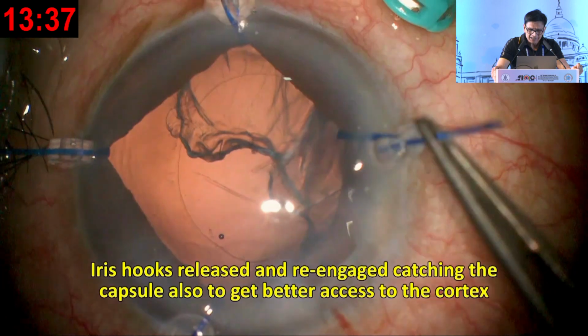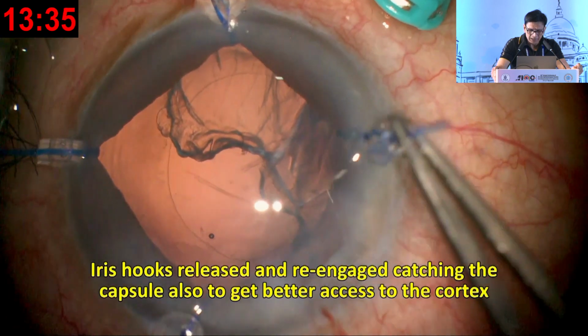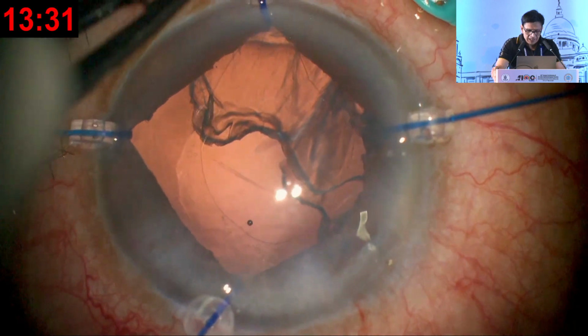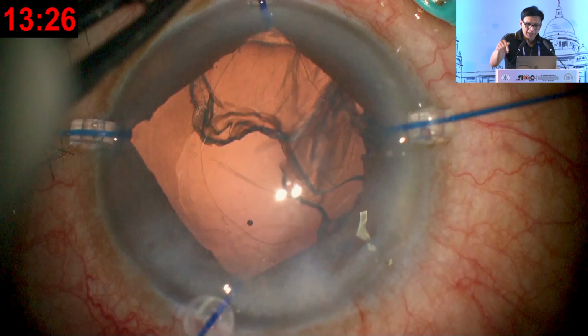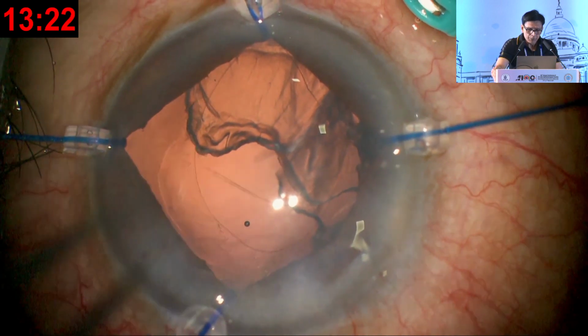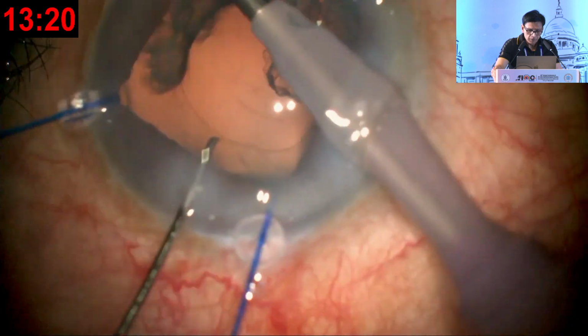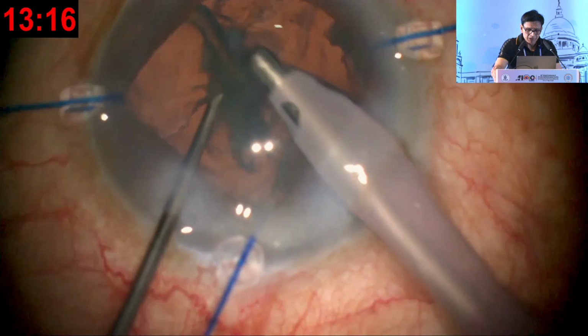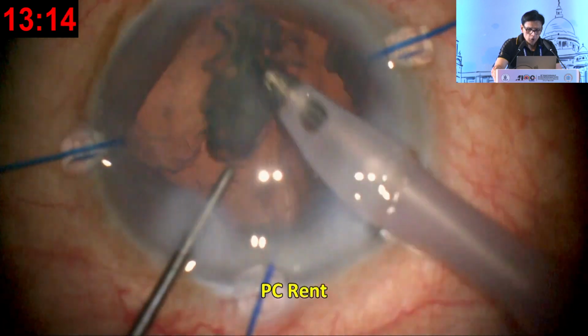And as things stand, I am looking perhaps a bit lucky, hoping everything will be all right. I release the iris hooks to catch the capsule. The same iris hooks I used to catch the capsule. It's a bit tricky because the capsule can get ripped open. Once that's done, I'm able to extend inside the rhexis much easier to remove the cortex.